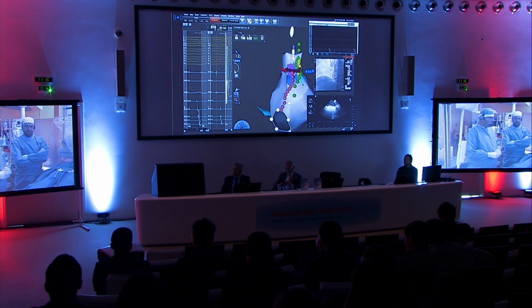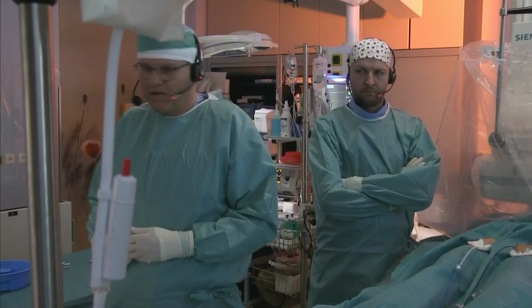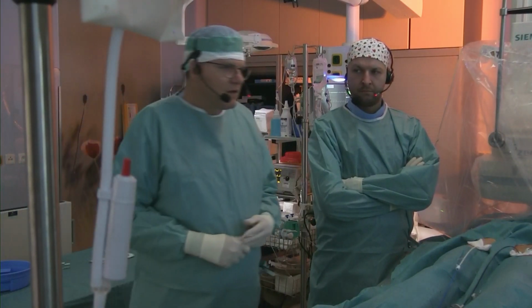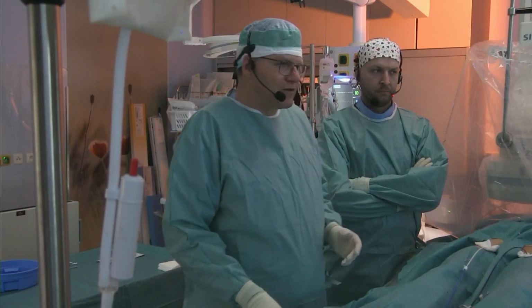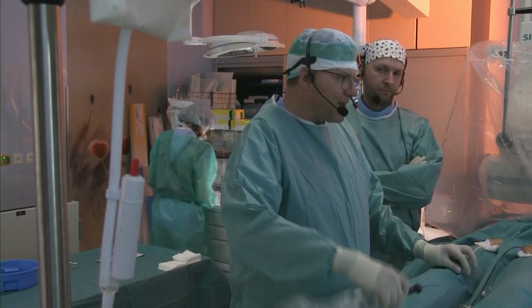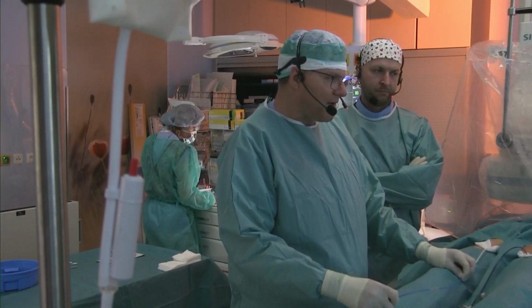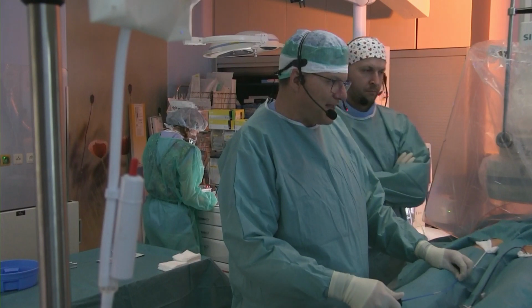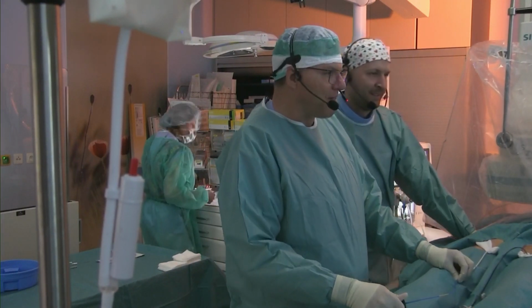Okay, do you want to say something more, Dan? No, I think we have nothing to add. If you want to close the session, we will pace the phrenic nerve again, but I don't believe that the recovery will be so fast.